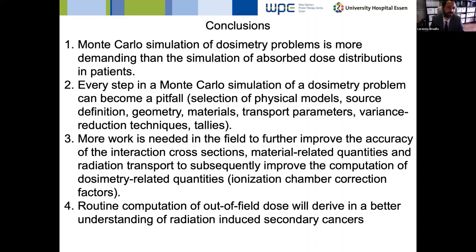A few people have been asking about whether Gate is suitable for simulation of hadron therapy, or whether PRIMO can be used for proton dose calculations. Do you have any comments? Gate, for sure, yes. Gate is another wrapper like TOPAS. I do not have experience with Gate, but what I've read is that it is possible. Your computation engine is Geant4.